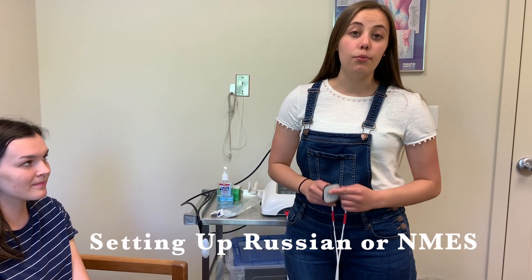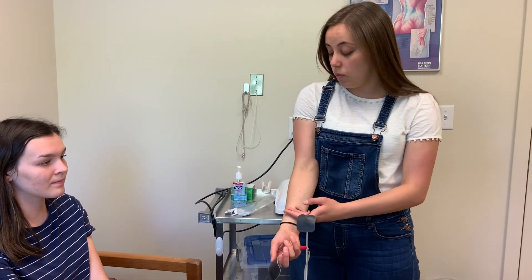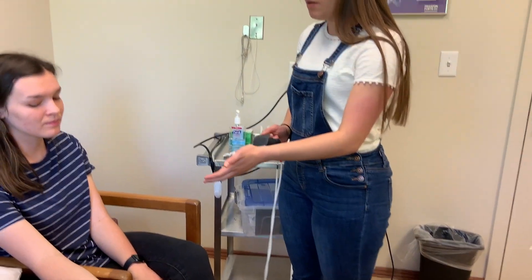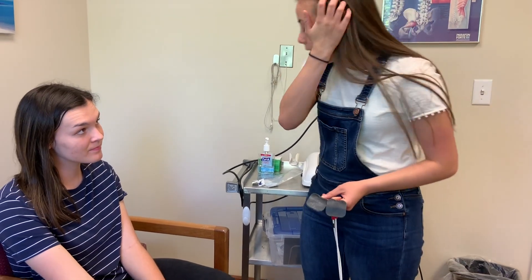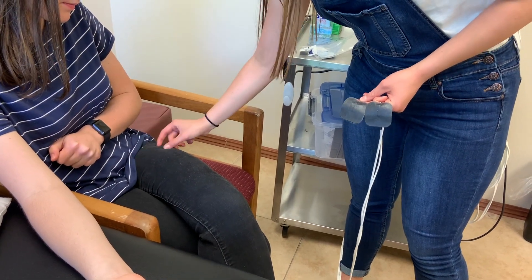Alright, so this is how you're going to set up Russian electrical stimulation on a patient. This is a little bit different than IFC and Premod in that we actually want to get a contraction. Usually we'll be doing this on the thigh muscle, but for demonstration purposes I'm going to do it on Megan's arm. If you were doing a thigh muscle, you would use the big pads and place them right here and all the way up here, kind of in the middle.